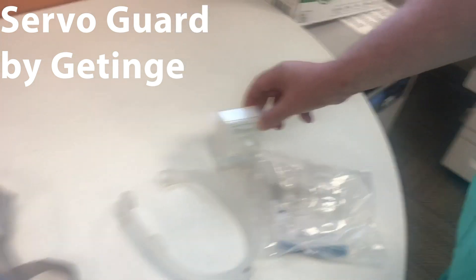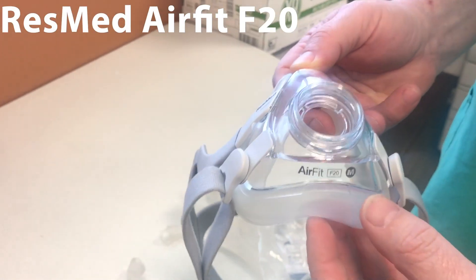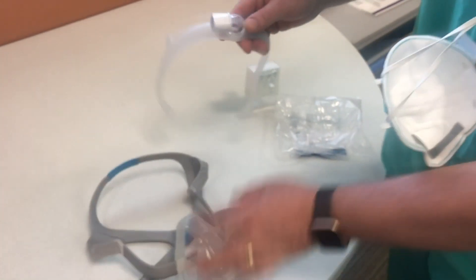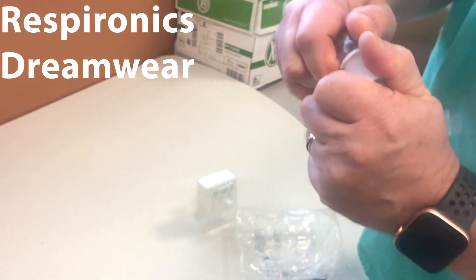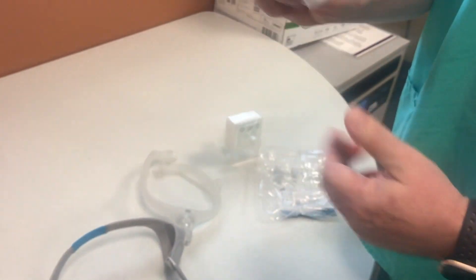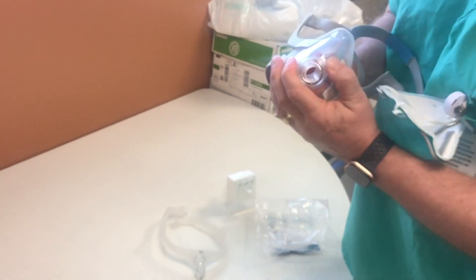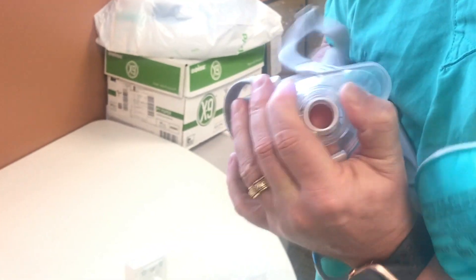So let's take one of these. I'll use the AirFit F20 — this is a medium size mask, and it'll also work for the large size mask. This is from a Dreamwear CPAP, so if you take off the connector off the Dreamwear CPAP, you can actually push it through — it takes some work — but you can push it through your ResMed mask, like so.